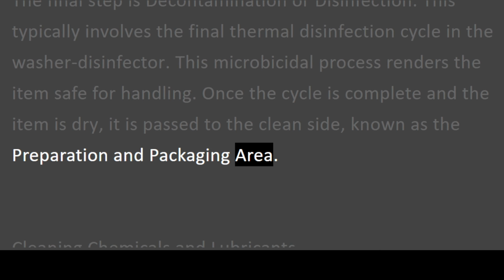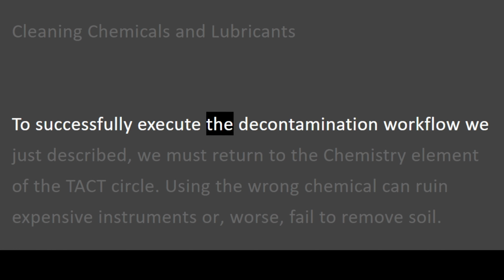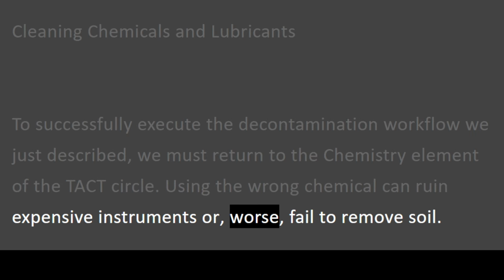Cleaning chemicals and lubricants. To successfully execute the decontamination workflow we just described, we must return to the chemistry element of the tact circle. Using the wrong chemical can ruin expensive instruments or, worse, fail to remove soil.